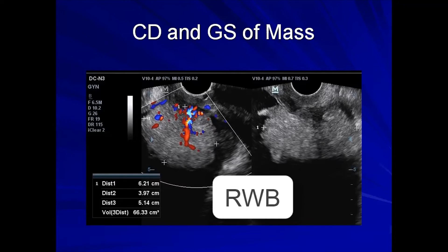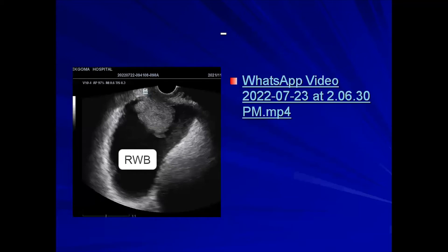There are areas of low-level echoes suggestive of a bladder hematoma, keeping clinically with the frank hematuria observed. The mass measured 6.21 by 3.97 by 5.4 centimeters, giving a total volume of 66 cubic centimeters — a substantially large mass. Color Doppler shows intra-lesional vascularity. Using the endocavity probe introduced rectally, a longitudinal section of the same mass shows low-level echoes in keeping with hematoma, and the bladder wall is thickened.